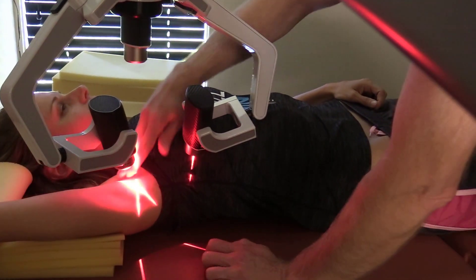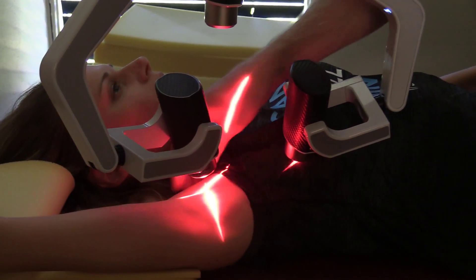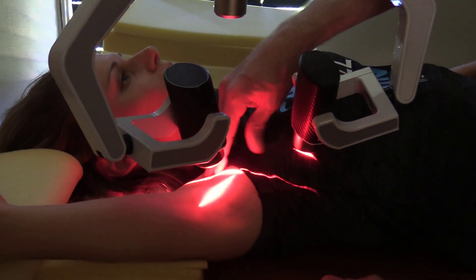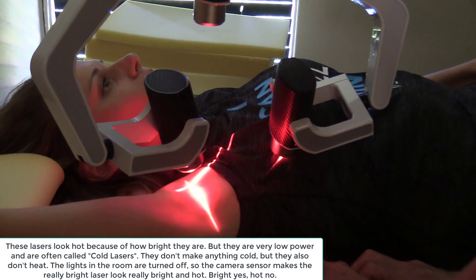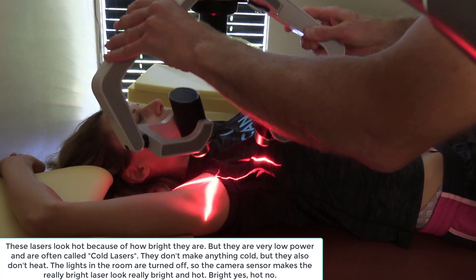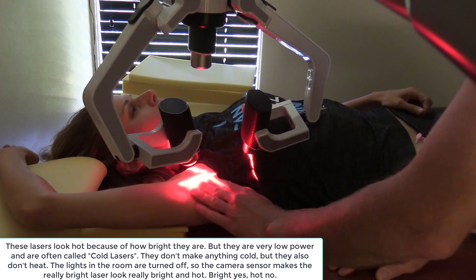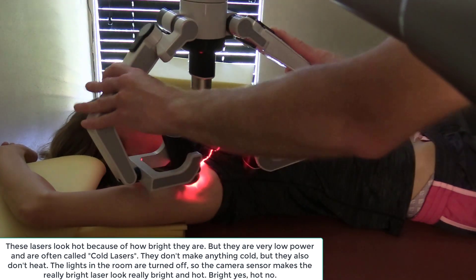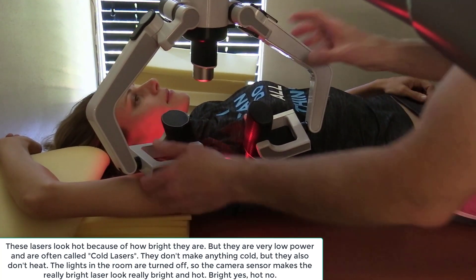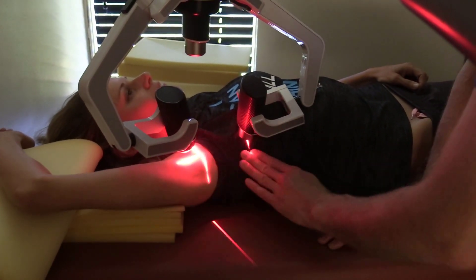Up here too is another spot — the coracobrachialis and the pecs. This can all be tight up here, and even part of this is deltoid. That too is an area that's real hard on her, and you really just can't cover everything at once with the lasers. If I tried, I'd have to pull them up a little higher to get the lines to be wider, but then the intensity drops too. So I like going a little closer — you can put it right up next to it, there's no harm there, but then your treatment area gets real small even though it's really effective. There's a nice in-between where you're getting coverage and concentration as well.